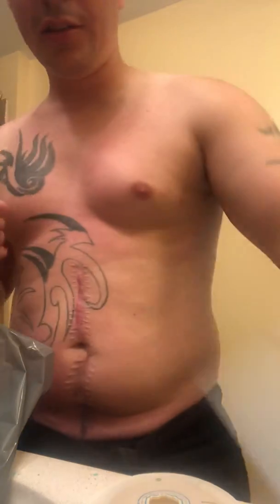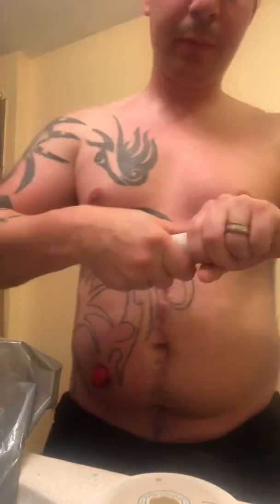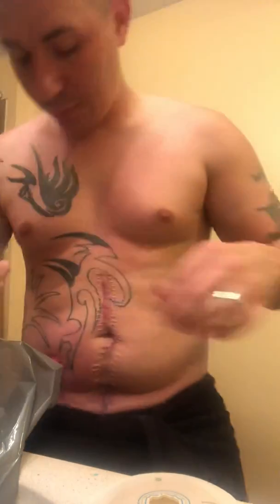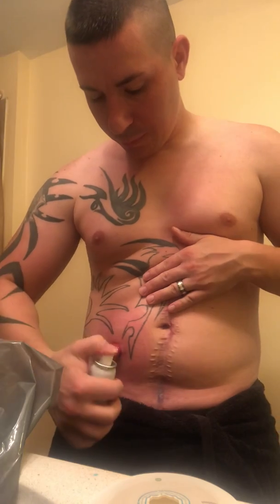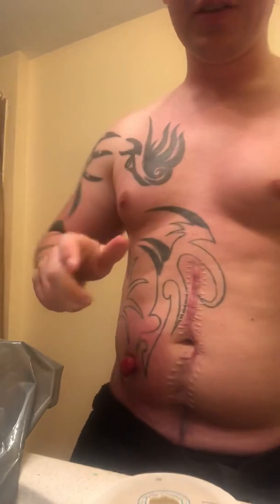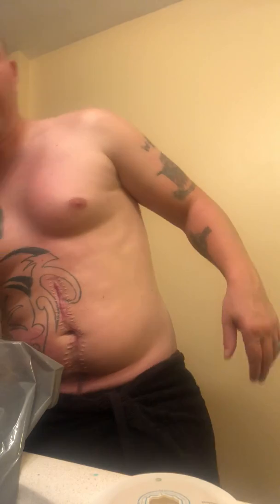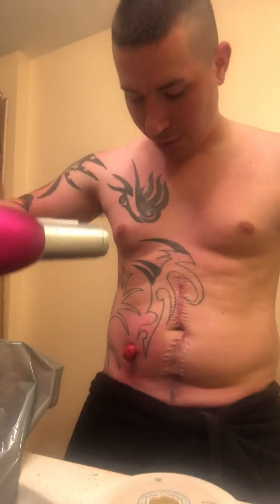All right. So the next step is our skin barrier spray. Get it nice and all the way around your stoma area. And then you're going to let that dry. And again, thanks to my lovely wife, I have this fancy dancy blow dryer, so we can speed things along.